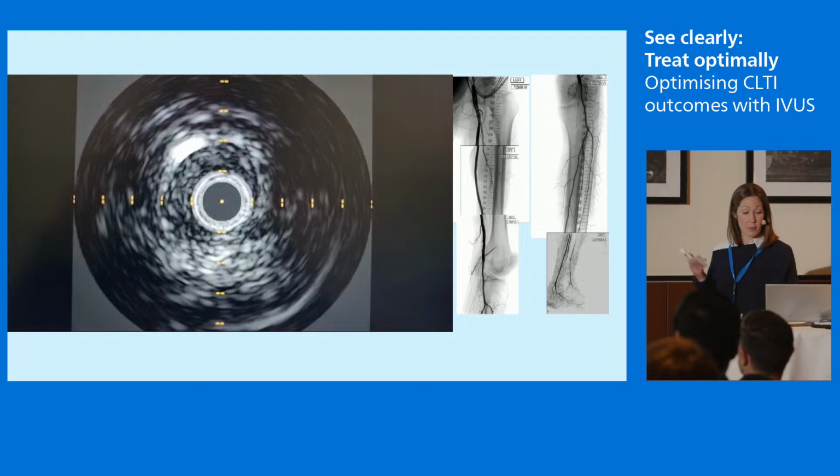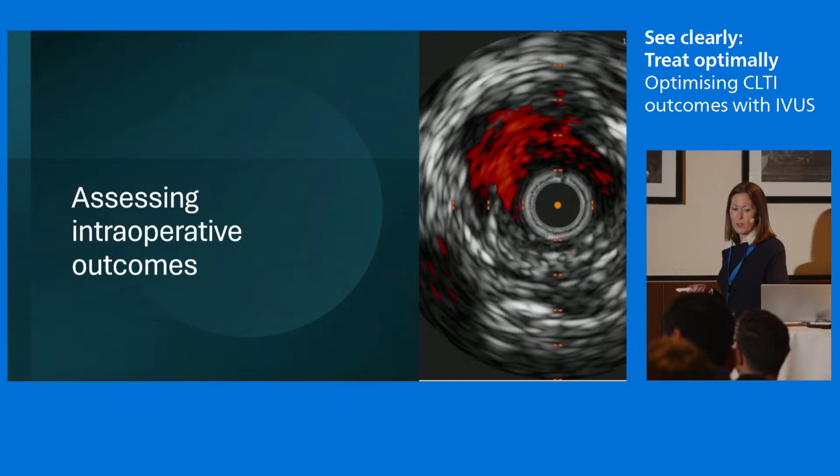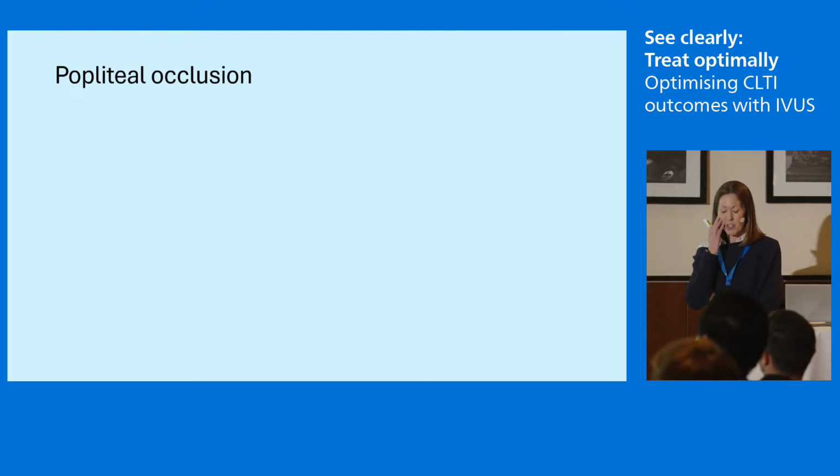So that was the reason I brought that case as an example. This is obviously another absolute triumph on my behalf. So, assessing outcomes. This was a chap with a popliteal occlusion.